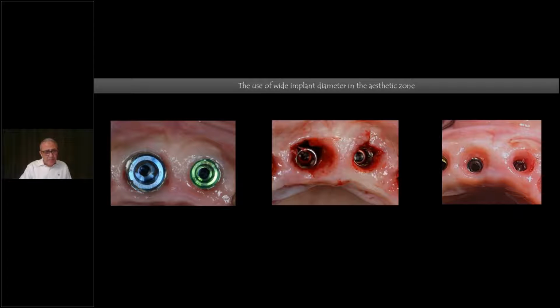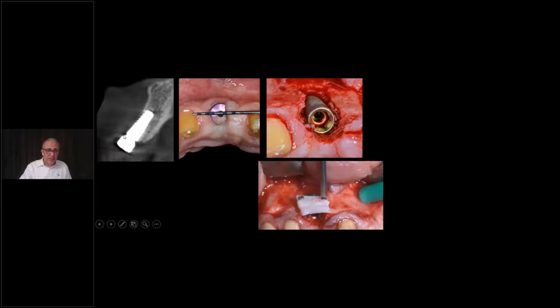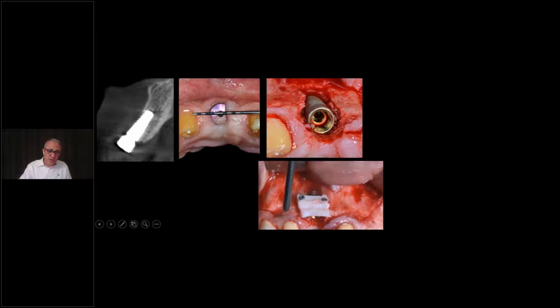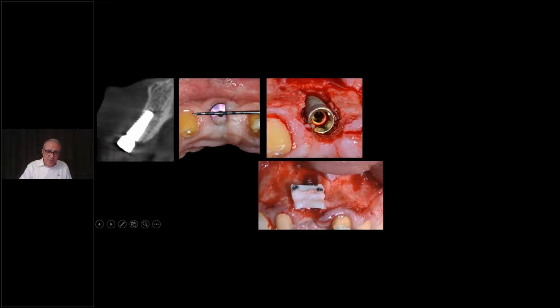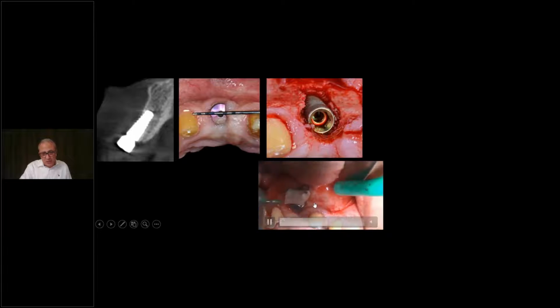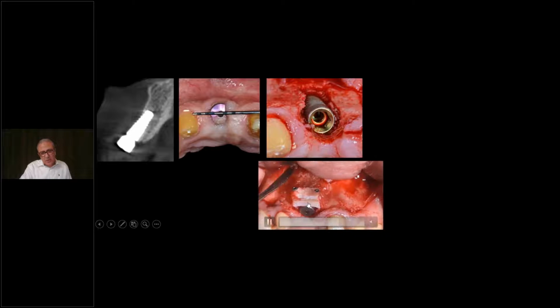Here is another issue. Using a wide diameter implant led to the extreme loss of the labial plate. And you see, this is also a violation in the position. The only way to treat this is to regain the natural emergence with a lower profile diameter implant and graft with whatever graft you like to use. I use here what is called a composite graft, that is hard and soft tissue together.